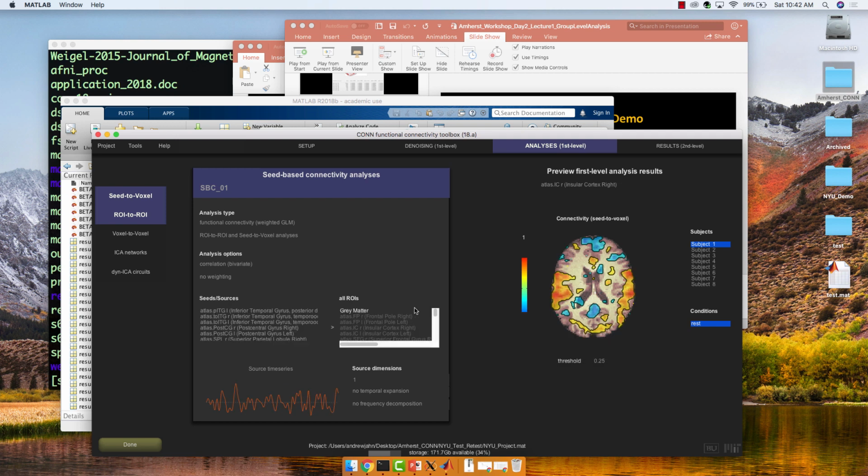Do you know if when they do that, they sort of weight it by ROI region size to account for differences in SNR between your two series? Good question. I don't think they do. Yeah. Or another way to put that is, would they weight it like a probabilistic atlas, right? I don't think that they do that. Yeah. I could be wrong, but I haven't seen anything in the documentation about that.